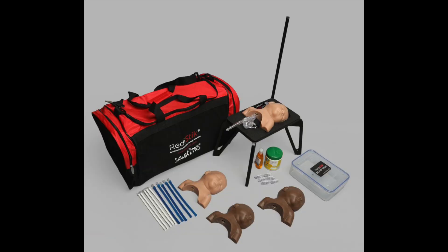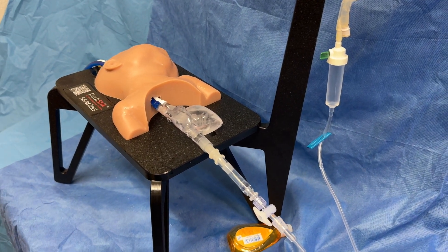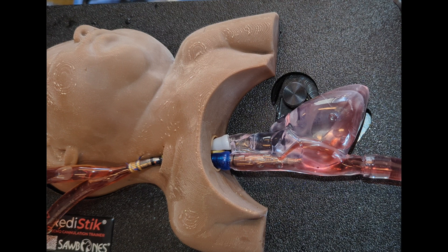We also have blood tabs that are included in the kit. For our simulations, what we found to work best is we do not put the blood tabs in the bag that primes the heart. We do put the blood tabs in the ECMO machine, and as we go on pump, it fills the heart with red.